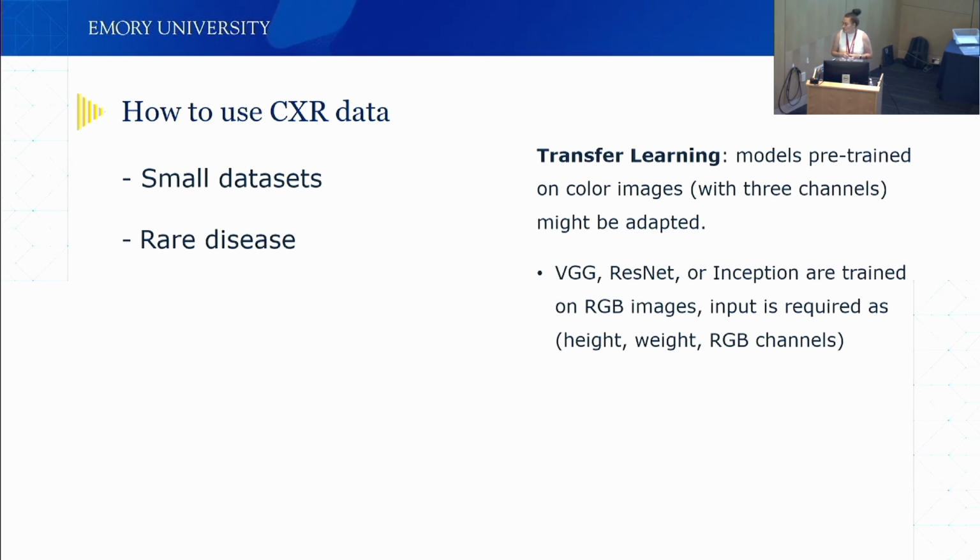So as you can see, it's not easy, especially with shortcut learning, to figure out what's the right grouping of patients, and even more difficult if you're using the public data sets that don't have DICOM metadata. So you have to really spend a lot of time. Marley looks at a lot of chest imaging, not just chest x-ray, to figure out what subgroup, like even just the support devices, which are not labeled this way. So quite a lot of ideas can come from this talk about how to structure or think about different subgroups around chest x-rays. Chest x-ray is a workhorse.